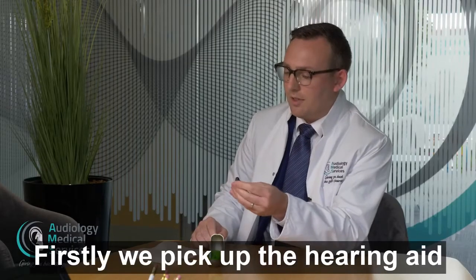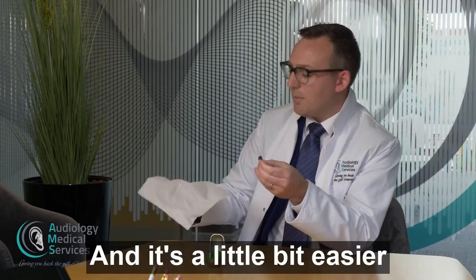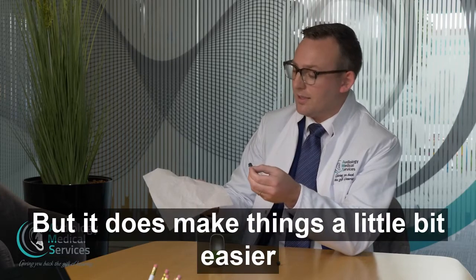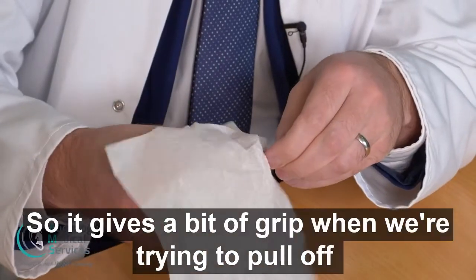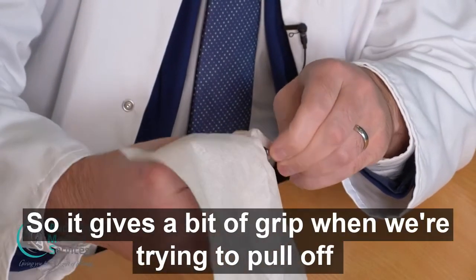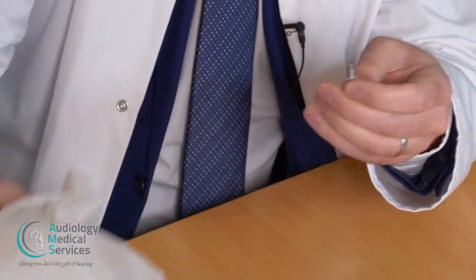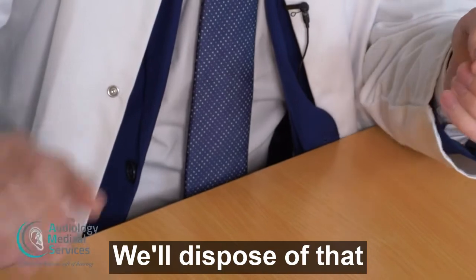Firstly, we pick up the hearing aid and it's a little bit easier when we use a bit of kitchen paper or a hand towel. You don't have to use it, but it does make things a little bit easier. It gives a bit of grip when we're trying to pull off — it's like a mushroom stem — so we want to pinch that off. Okay, we'll dispose of that.